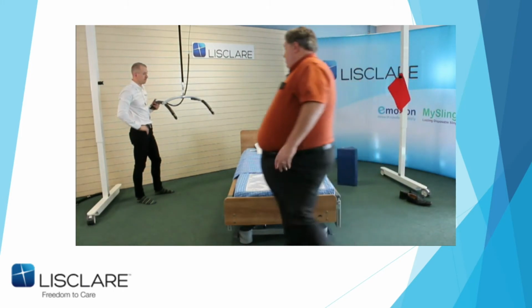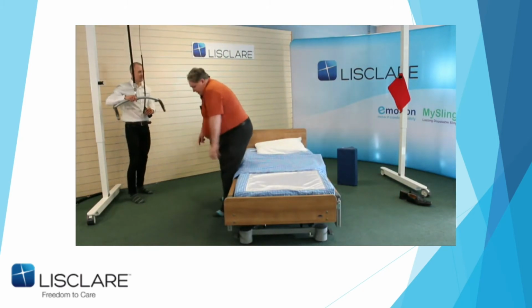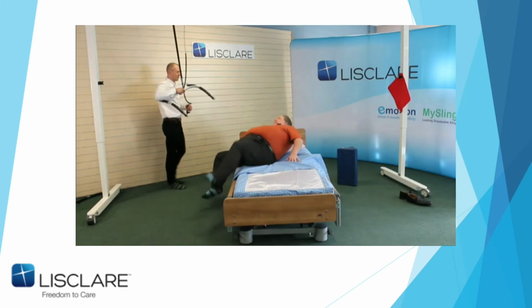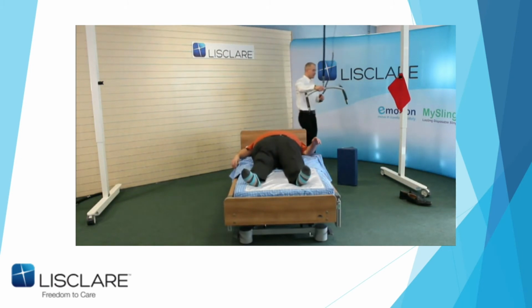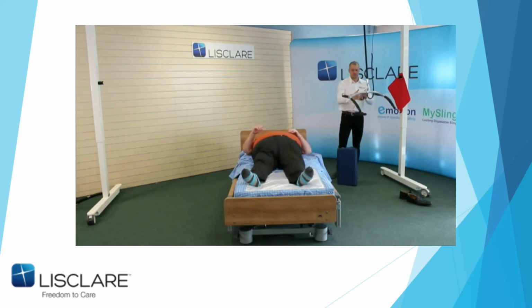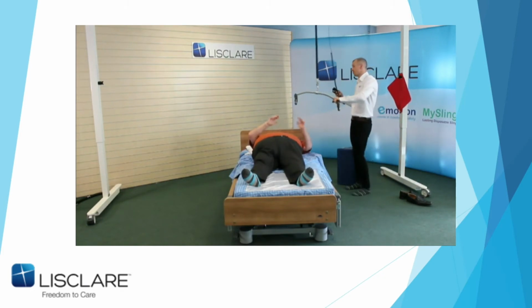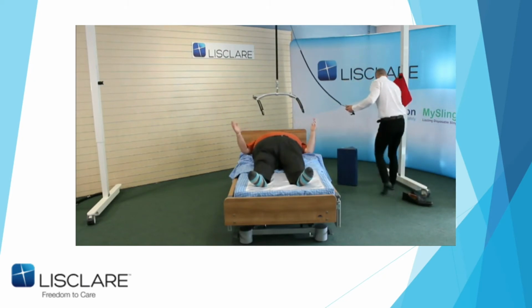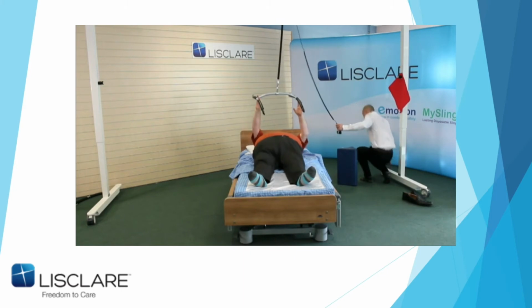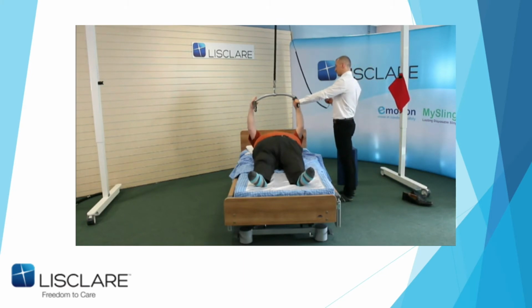Now, I'm just going to, for some strange reason, I like getting out of bed this time. Just realised this is my side. I just realised why I did that. So, John's going to come in and attach the same way as he attached before. There you go, John. And if he takes the brakes off the hoist and the gantry, it's kind of like a mobile hoist. It means that the mobile hoist will move into the centre of gravity of the load. It's great, I have to admit. So down we go.